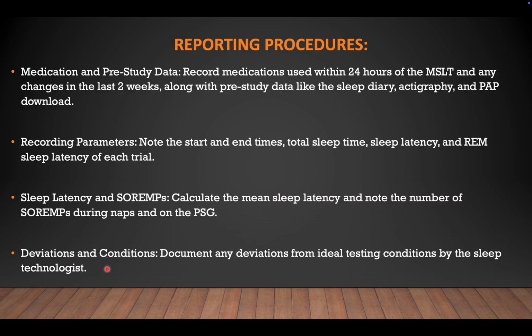And deviations and conditions, as we discussed earlier, sometimes the patient may not be able to wean off the antidepressant. So it has to be documented, because sometimes there may not be REM sleep at all, or there was some significant noise, or, as with the last patient, the presence of a girlfriend. These need to be mentioned in the report to make the final report clear.